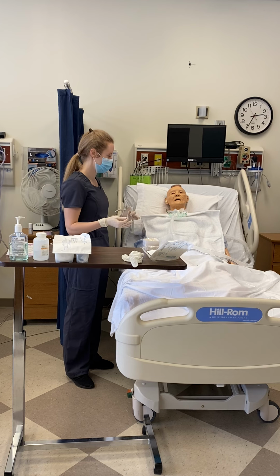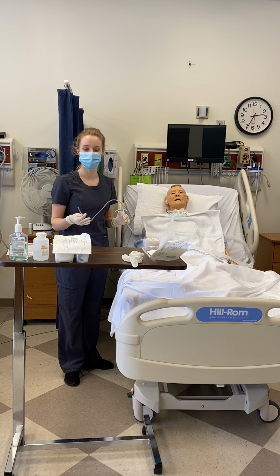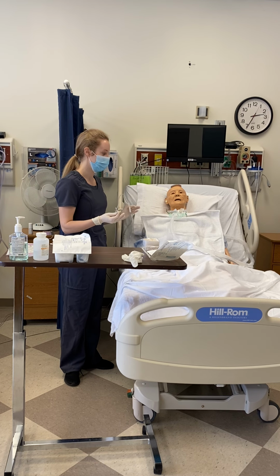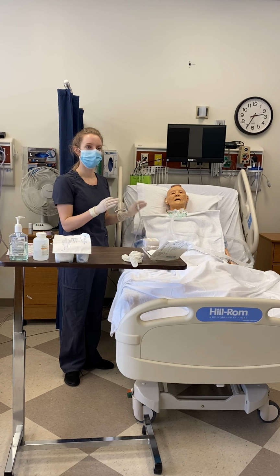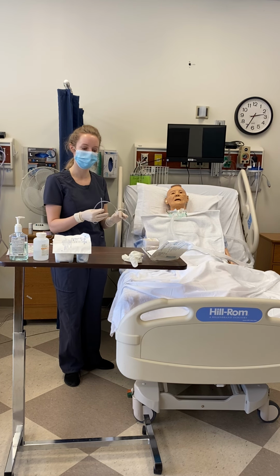And when I'm done, I want to ensure his oxygen saturation is back up to a good rate. His breath sounds are easy and natural. He's essentially having no trouble breathing. And then after his oxygen is returned to a normal rate, I do want to return his oxygen to those pre-hyperoxygenation levels. Turn off the suctioning after everything's cleaned out.